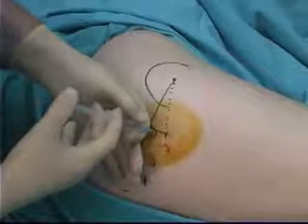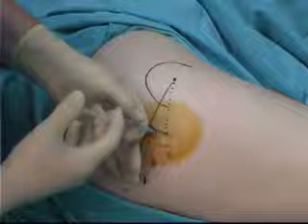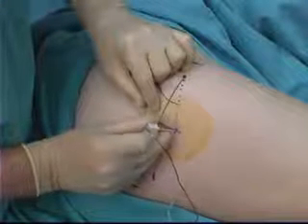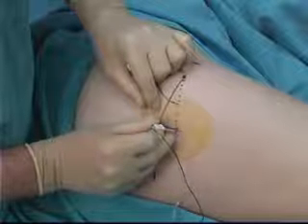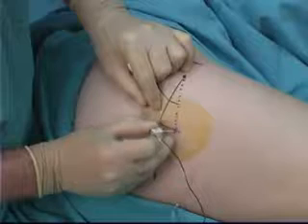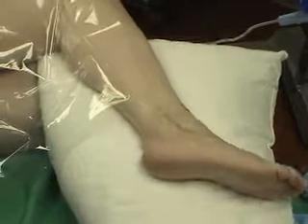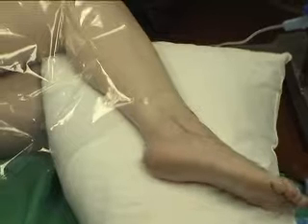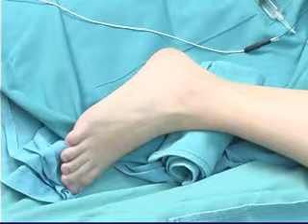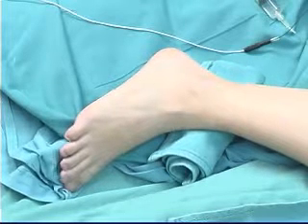After disinfecting the skin, the skin and subcutaneous tissues are infiltrated with local anesthetic agent. The 22-gauge 50 to 100 millimeter stimulating needle enters the skin perpendicular to the skin until the sciatic nerve is stimulated. If the medial aspect of the sciatic nerve is stimulated, the motor response will be plantar flexion of the foot. More lateral on the sciatic nerve, the motor response will be eversion of the foot.